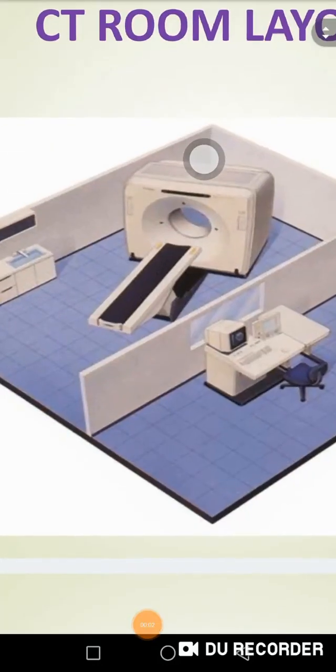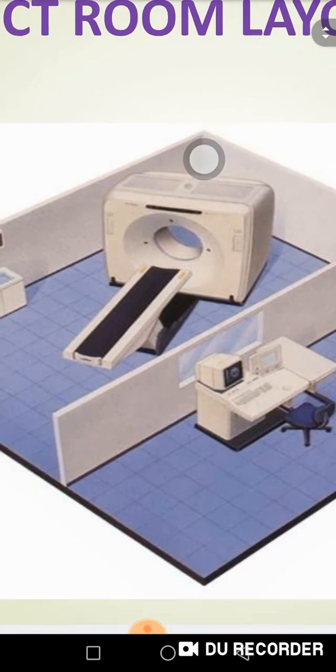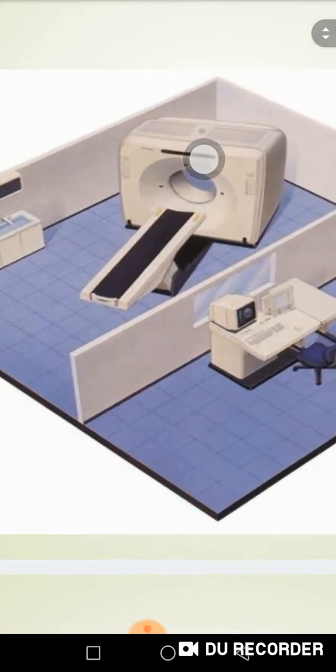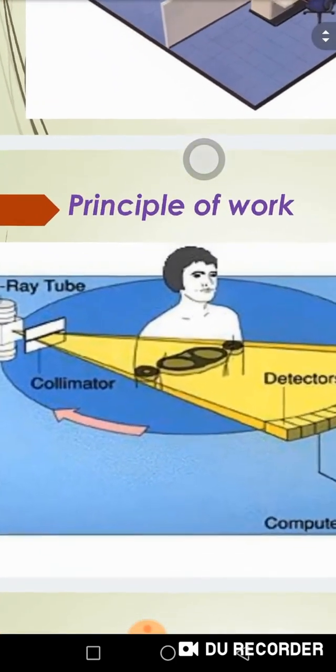As we mentioned, any issues with electricity can damage the hardware components of the device, so I must ensure that the electricity remains stable at all times. If there is a power cut, I need to respond to the system quickly to prevent any impact on the components. Now, what is the working principle?